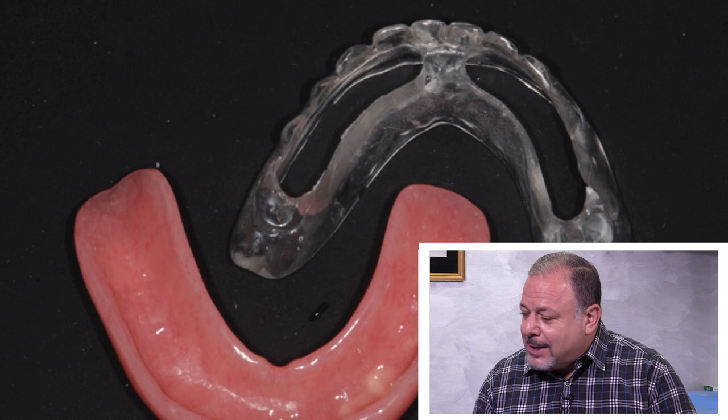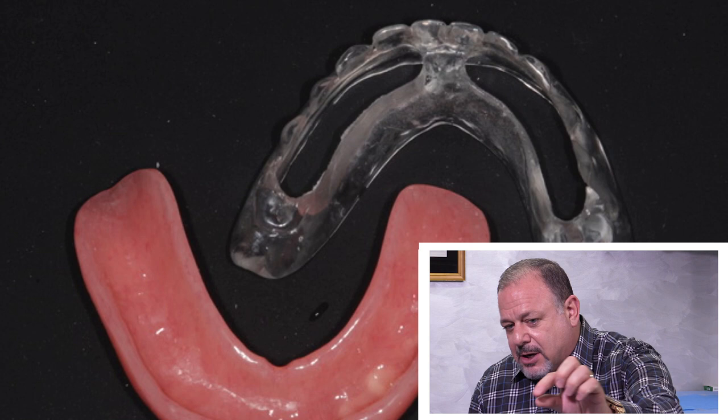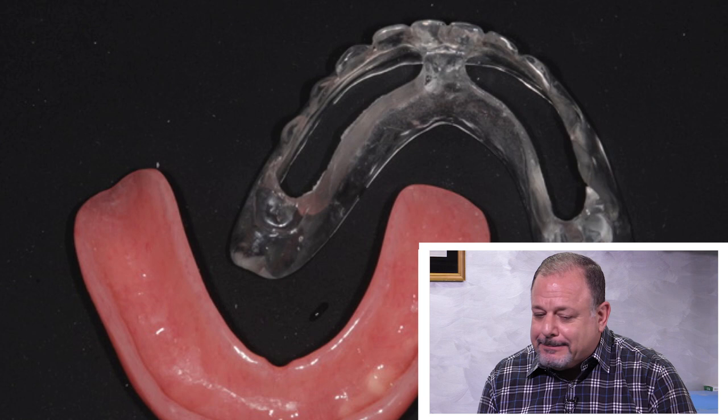And then with the clear guide, I can put it in and literally see that I'm there, plus the clear aspect that's cut out. We're going to use that to see where our spatial arrangements are of the abutments that we're putting in. That's great. So here's after the ridge reduction.